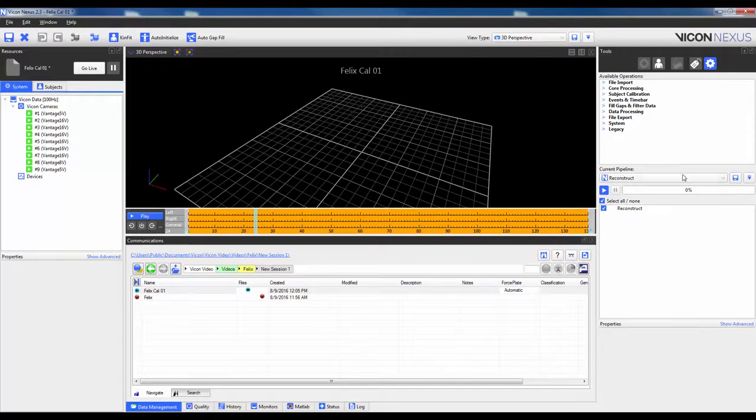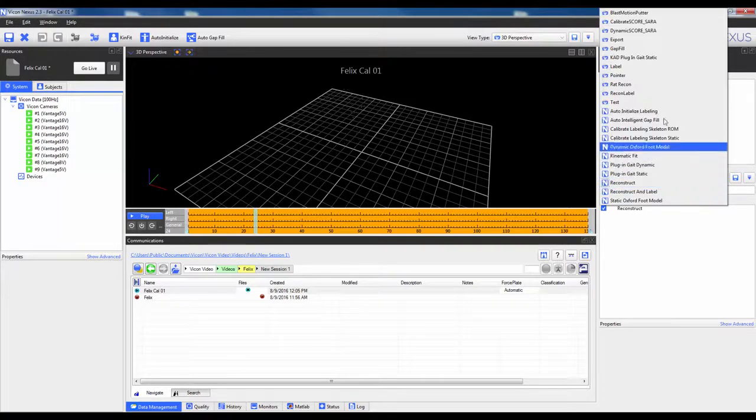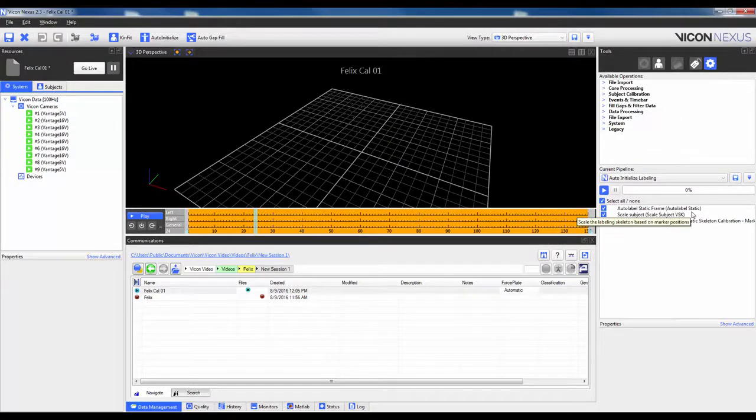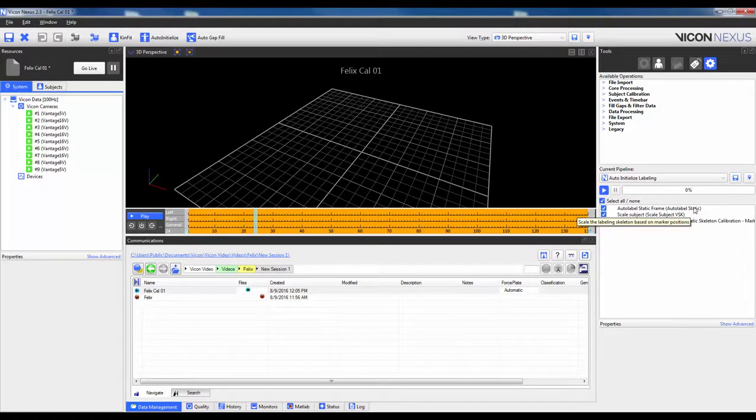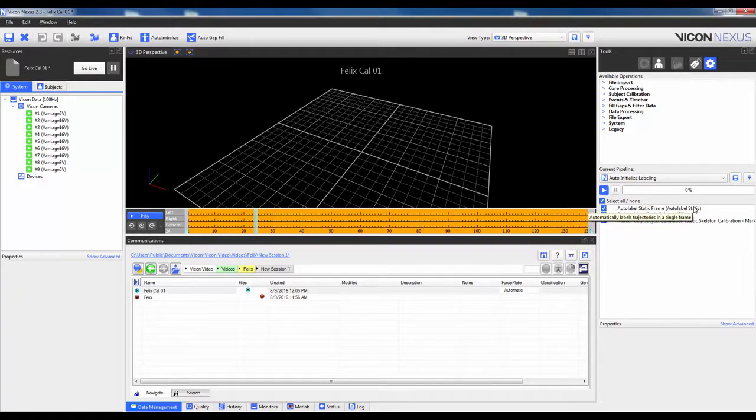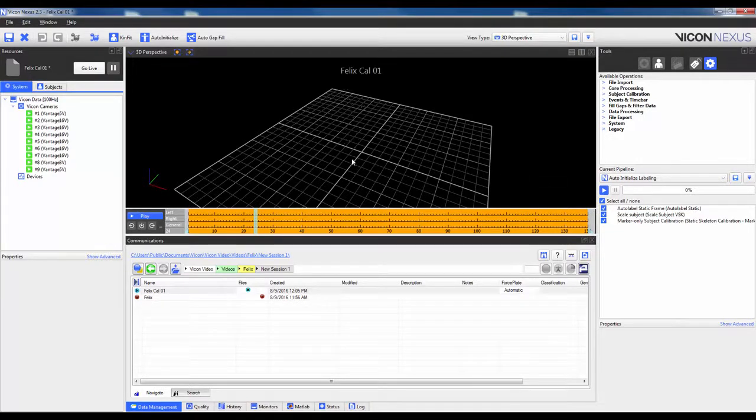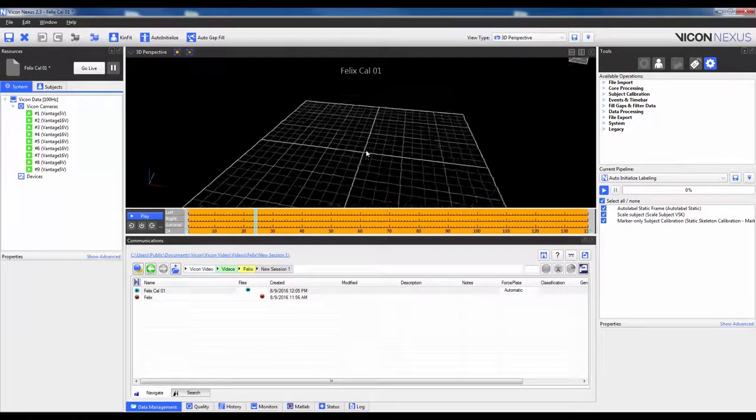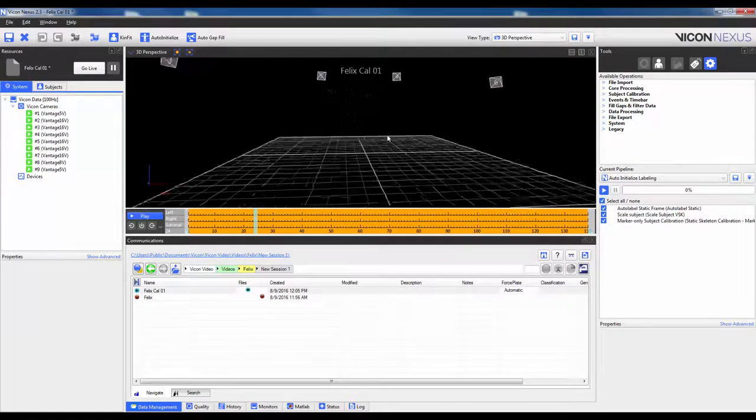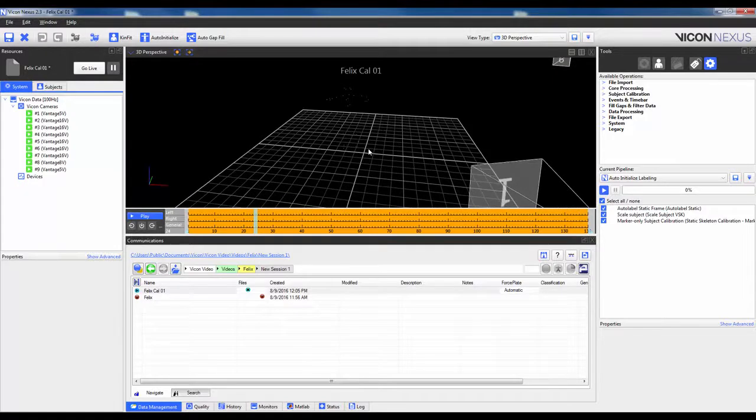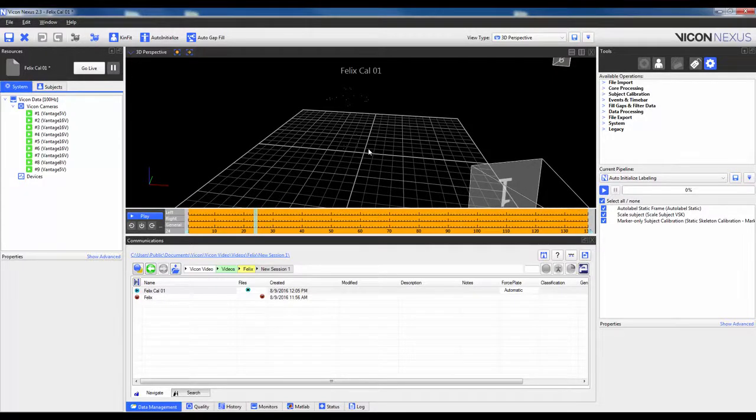If I navigate to the pipeline tab and change to auto-initialized labeling, you will see that it consists of three steps. The first is auto-label static. As the name suggests, it will automatically label a single frame within the calibration trial. By default, this will be the current frame you are on. Before running this operation, it is important to check that all the markers are there, and there are no ghost markers near the subject. Failure to comply with either of these two provisions will likely cause some incorrect labeling.